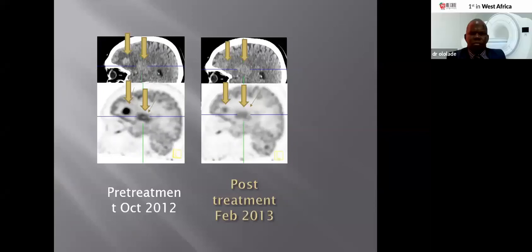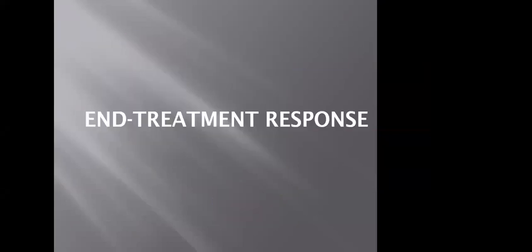This was a case of glioma after treatment, and the PET scan clearly showed that though the lesion has significantly regressed, there is still quite a bit of residual disease left behind. Coming to end treatment response. Next slide. This was a case of NHL after full treatment.